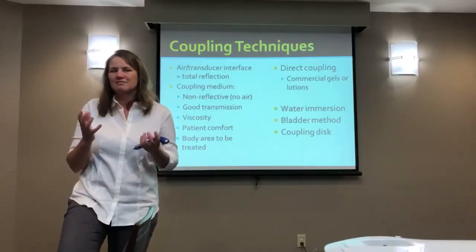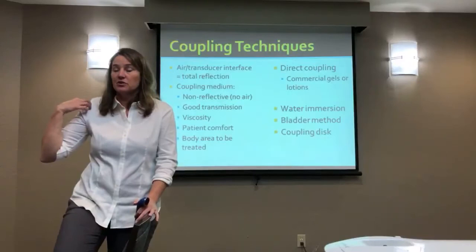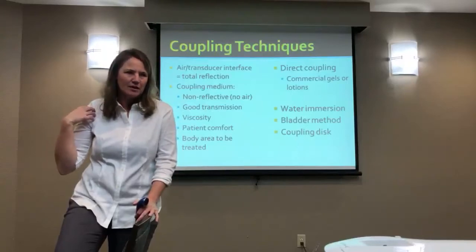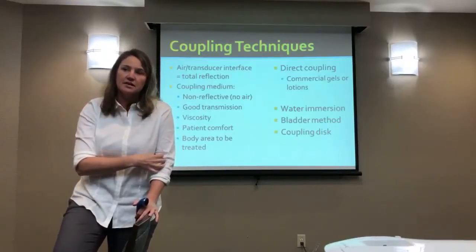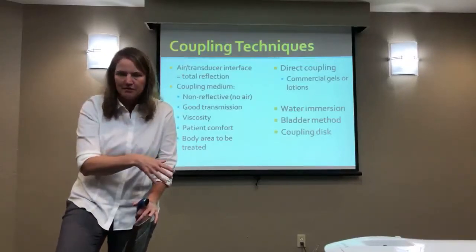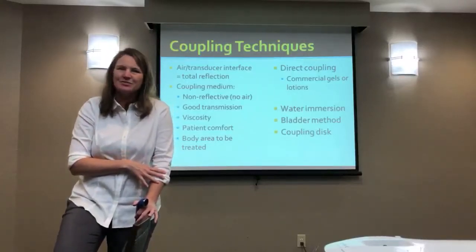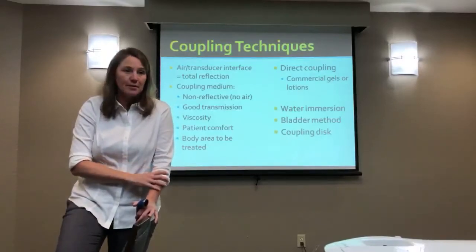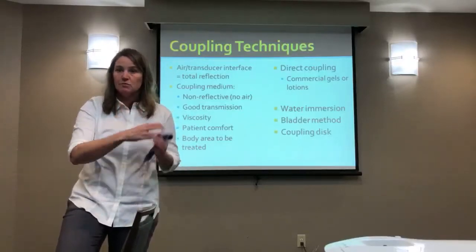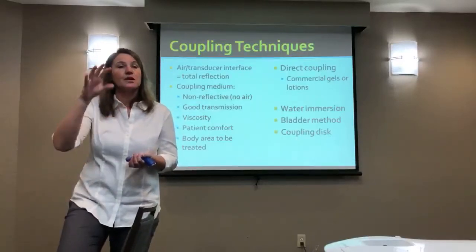First of all, I don't know how it might impede the ultrasound, or exactly what the ingredients inside those gels are, and if it could be harmful. And I don't see the benefit of ultrasound going over it anyway, because where it works is on the skin, and the cutaneous nerve endings are what it actually needs to affect. I've had people say it would be like phonophoresis, and drive it in, get better deep pain relief. And I'm like, that doesn't really add up. It's not intended for that purpose. So my recommendation would be, don't use it as a coupling medium. Do your treatment with proven, safe methods, and then if you want to follow up with an application, put it on after the fact.